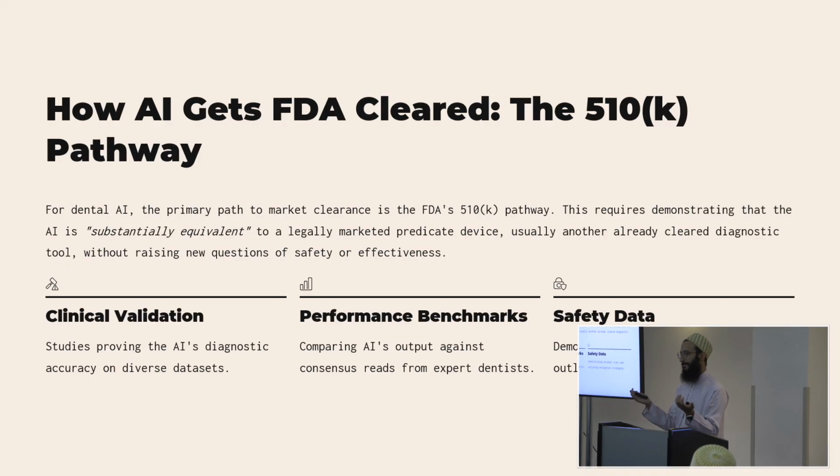And so just the nature of the equipment meant that the AI had to be good on poor resolution radiographs, right? So that's a little bit baked in. Maybe that's changing and it's kind of biasing towards good quality ones now. I'm not sure.